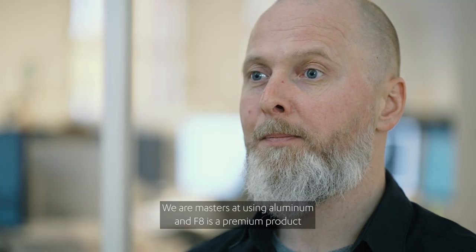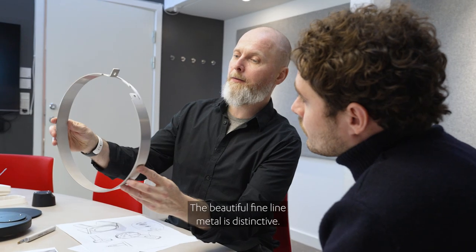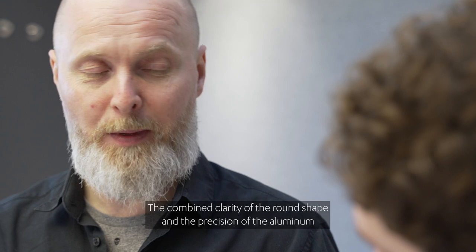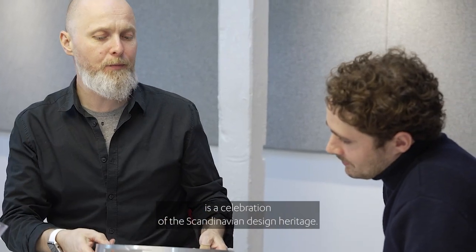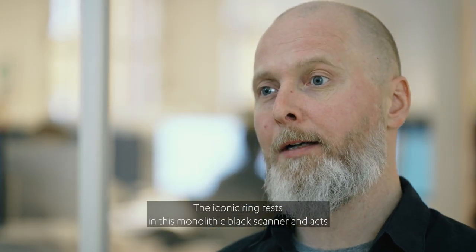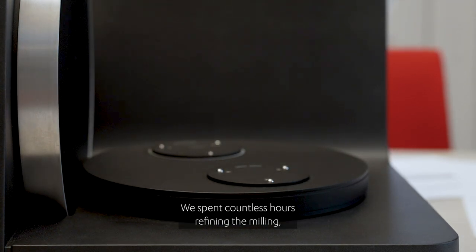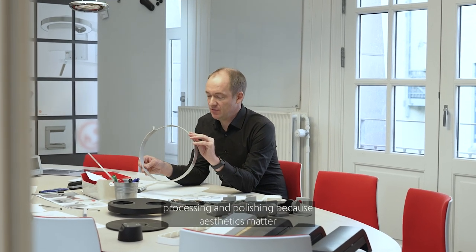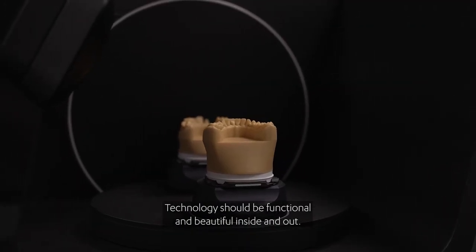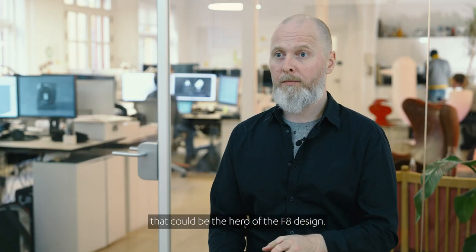We are masters at using aluminium, and F8 is a premium product, and therefore we need to use premium materials. The beautiful fine line metal is distinctive. The combined clarity of the round shape and the precision of the aluminium is a celebration of the Scandinavian design heritage. The iconic ring rests in this monolithic black scanner and acts as a meeting point where coldness and motion converge. We spent countless hours refining the milling, brushing and polishing, because aesthetics matter. Technology should be functional and beautiful inside and out. To our mind, there was no other material that could be the hero of the F8 design.